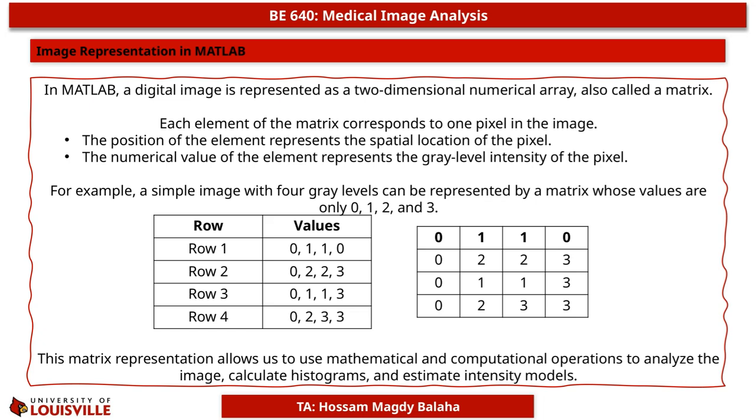This representation is important because it turns an image into something MATLAB can calculate with directly. We can examine individual pixels, apply mathematical operations, compute an intensity histogram, and estimate models that describe the image's gray level distribution. In medical image analysis, that provides a foundation for processing and interpreting images systematically, rather than treating them only as visual objects.